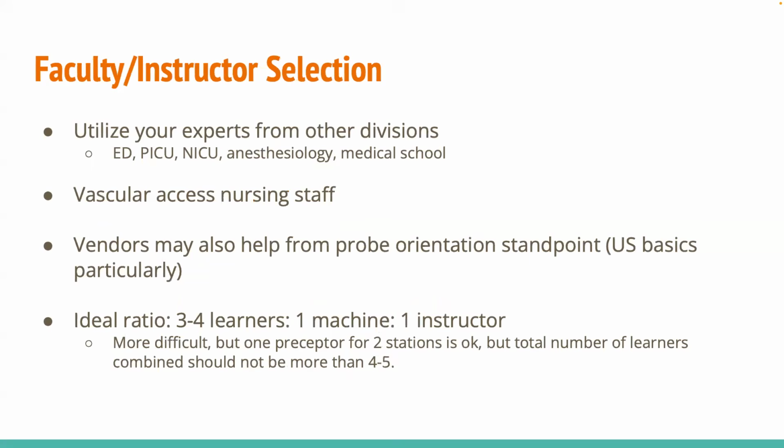Again, with faculty and instructor selection, you can get a little creative, especially if there isn't a program already. So if you have ED, PICU, NICU, anesthesia, people from the med school, they may not be affiliated, they may not know peds very well, but you really just need people who can help with probe orientation and some of those basics.